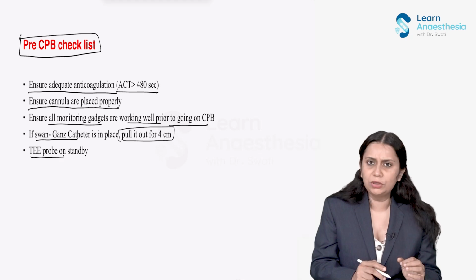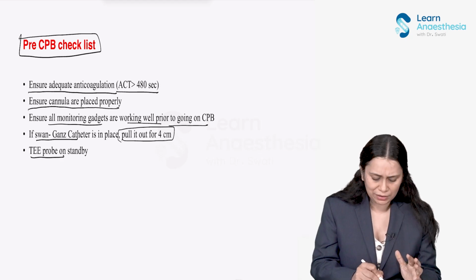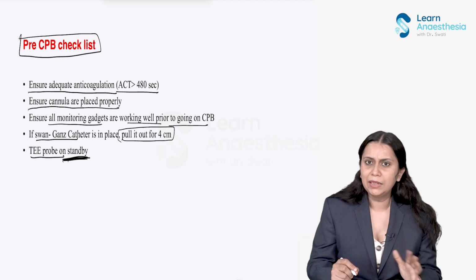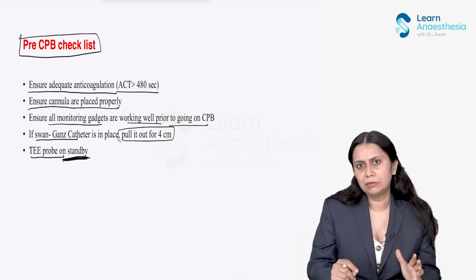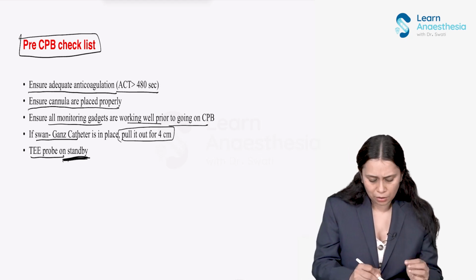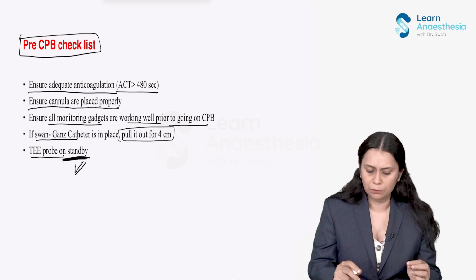And the TEE probe, the transesophageal echocardiography probe, is kept as a standby in case of an emergency, when we need to diagnose any problem of the heart. So the probe should be kept in standby.